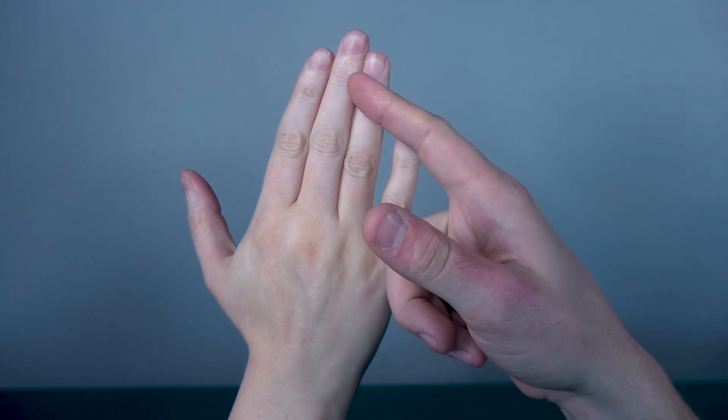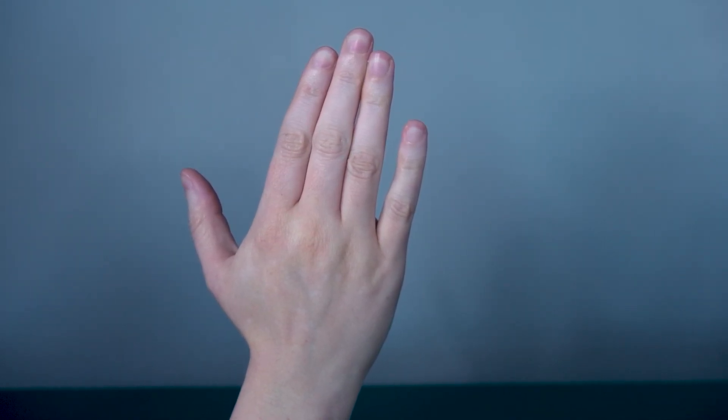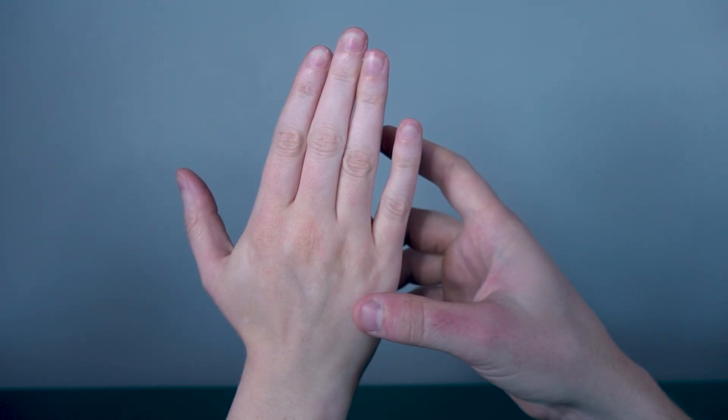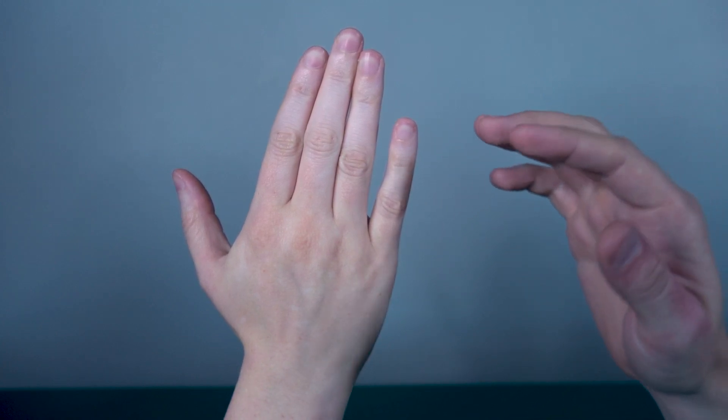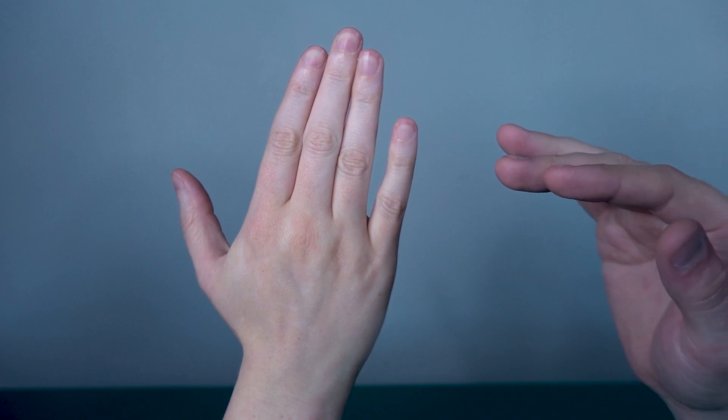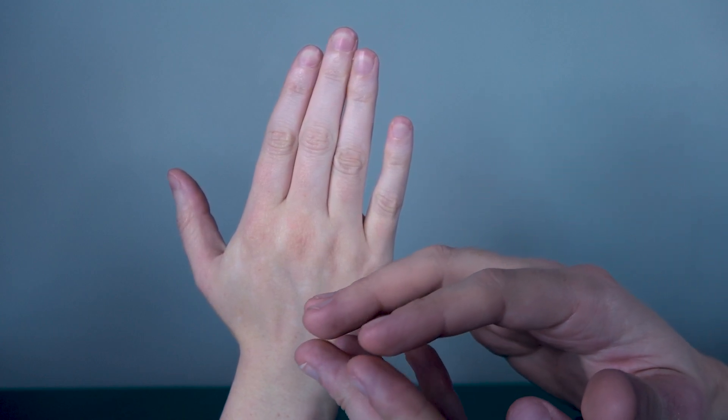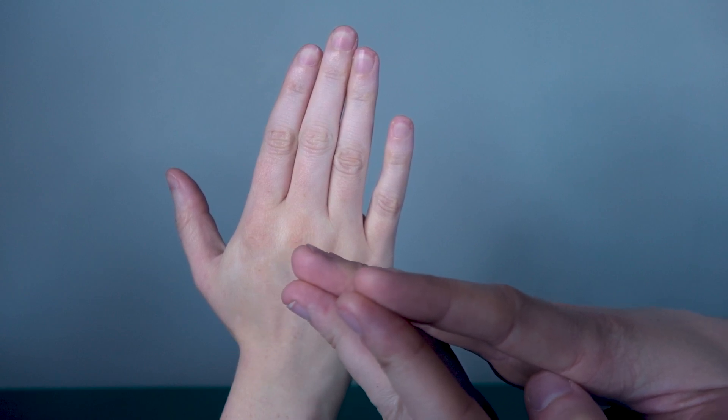When measuring PIP and DIP extension, the patient will be in a seated or comfortable position. The hand can be resting on its side on the table or up in any position you want. Whatever position you have the patient in, make sure that the fingers are not resting against an object to promote more extension than they actually have.